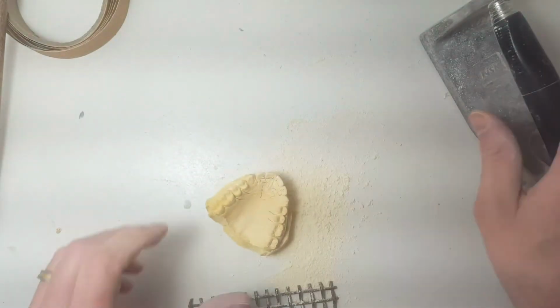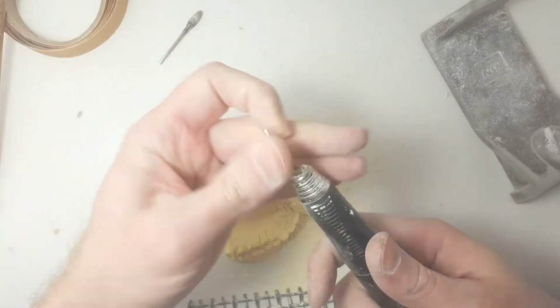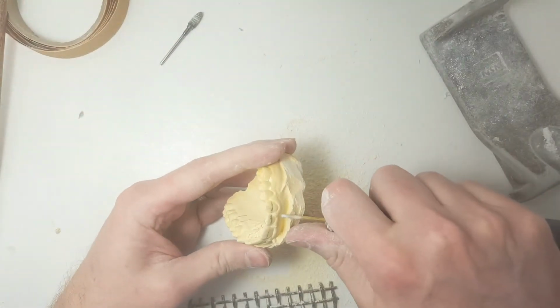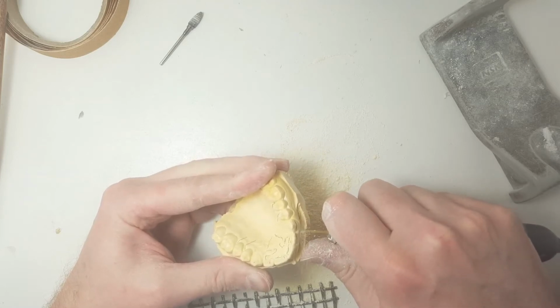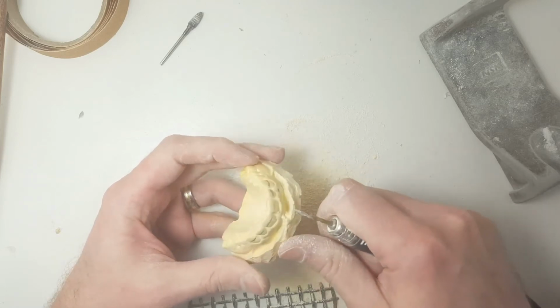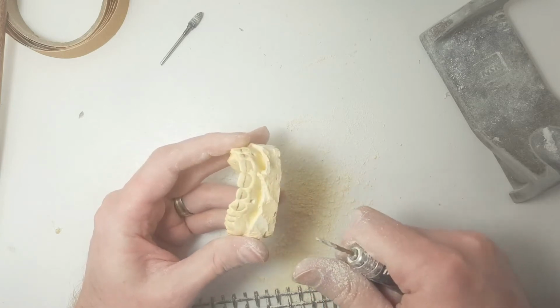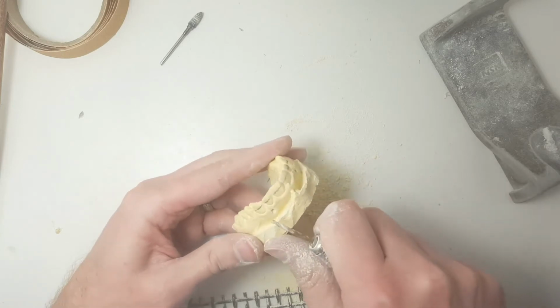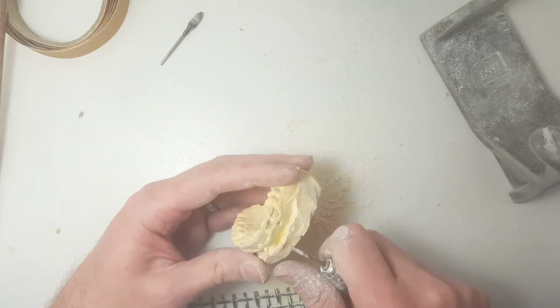Okay, we're back. So just like before, I'm going to take my little drill here. I don't know the size of this drill. I want to say 5/8, but I could be totally off. But you can see how fast it goes through. And I'm going right between the canine and the lateral.